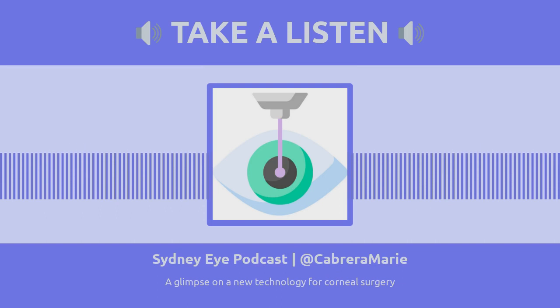After you laser the patch, what is the next step? Do you need to place a bandage contact lens, or anything to protect the eye? At the moment, we are seeing very, very strong adhesion onto cornea surfaces to a point that it's almost difficult to peel it off, if you want to call it. But it also depends on the native anatomical environment where this patch is deployed.